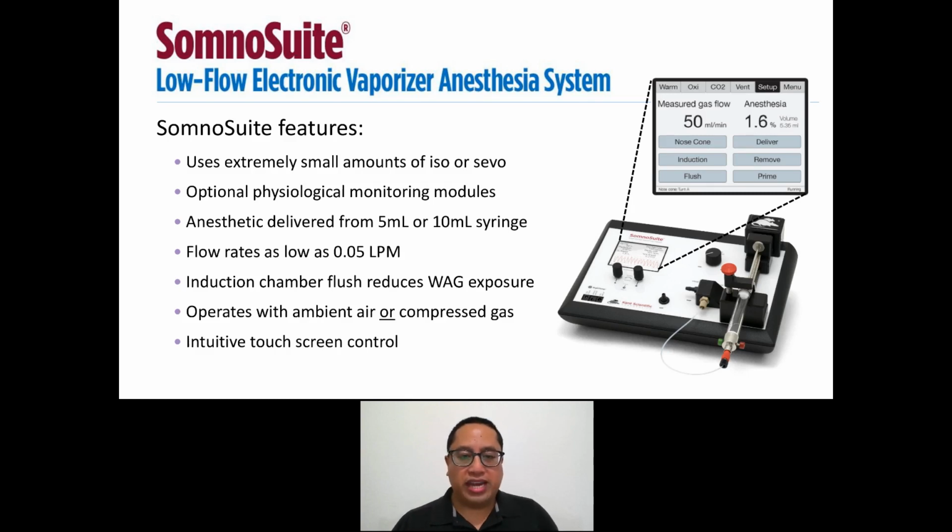When you are ready to remove the animal from the induction chamber, the flush button will add a layer of air with no anesthesia to reduce waste gas exposure.